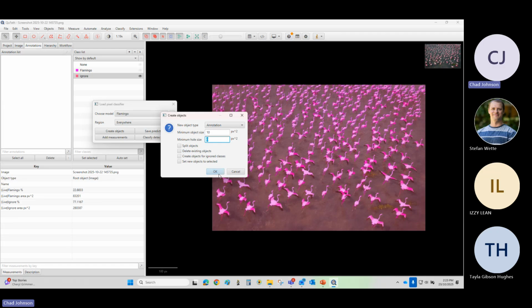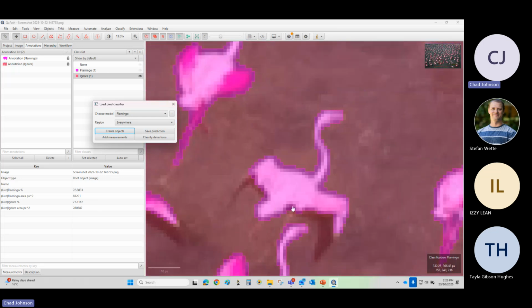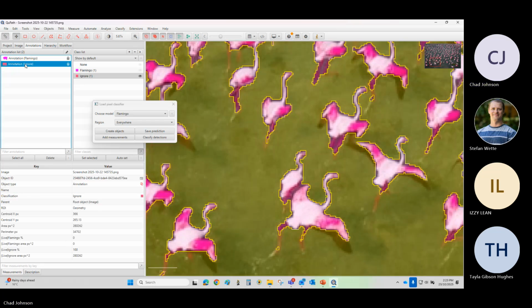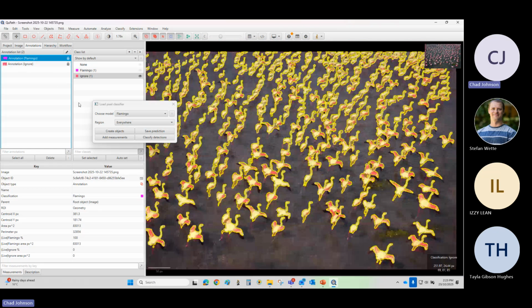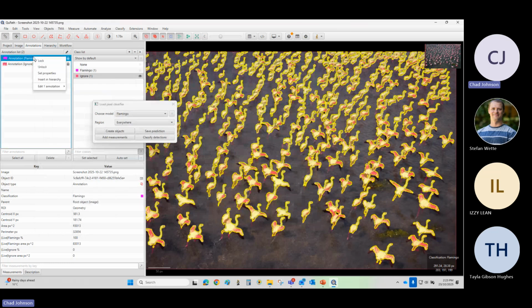And then I go, okay. And now we can see a whole bunch of ROIs have been drawn around all of my objects. So if I turn off the signal, we can actually see all of these ROIs around the objects. There we are. And then we can go into show annotation measurements. And we have a whole bunch of measurements. Now, that's based on the annotations. So I think you have to measure, show detection measurements.